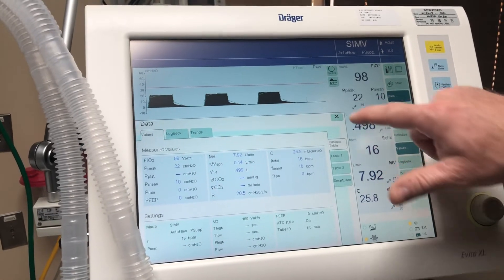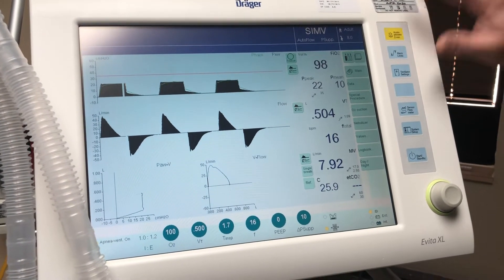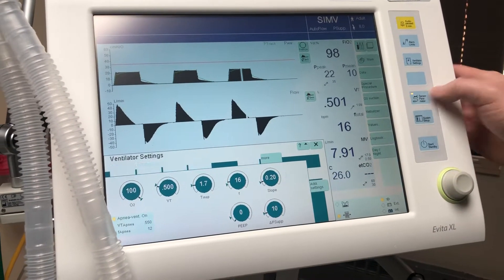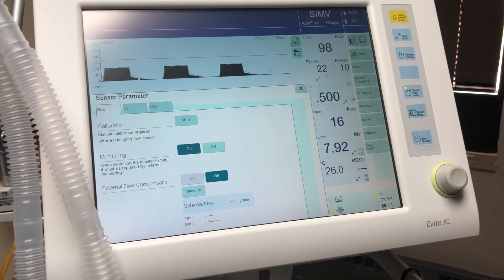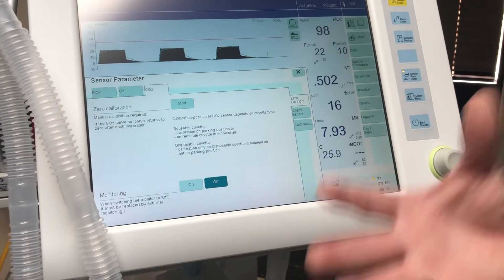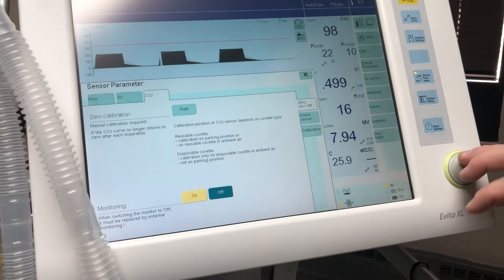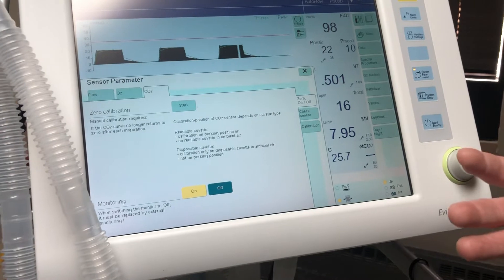We'll close that out. Here's your alarm silence — if it is alarming, hit that and it silences for about two minutes. Ventilator settings brings up those controls. Here you have your sensor parameters, which covers your oxygen sensor and CO2 sensor. Right now the CO2 sensor is turned off because we don't have it hooked up to the patient. To turn it on, hit on — but if you don't confirm with the button, it will not acknowledge and will stay off.